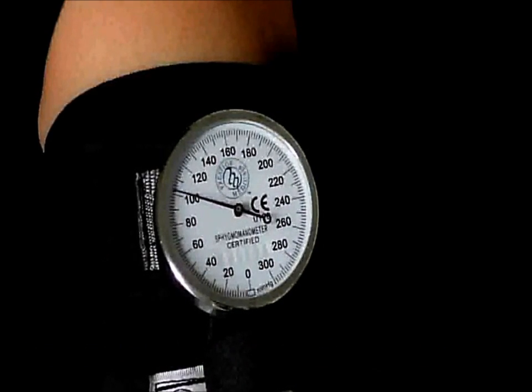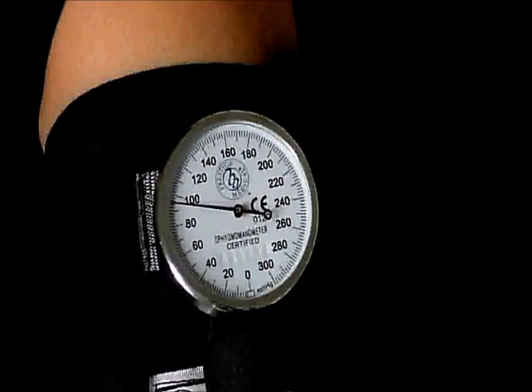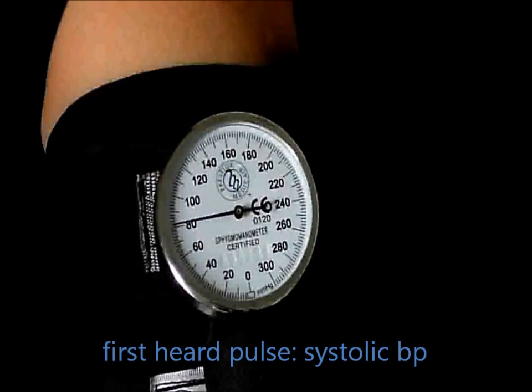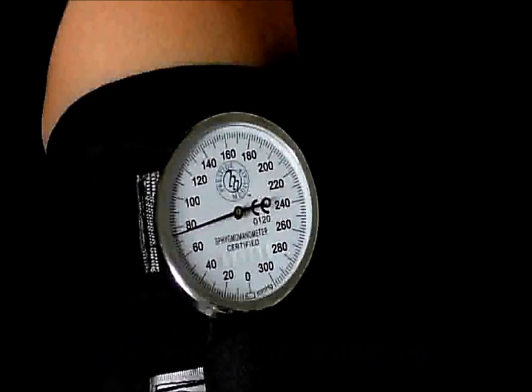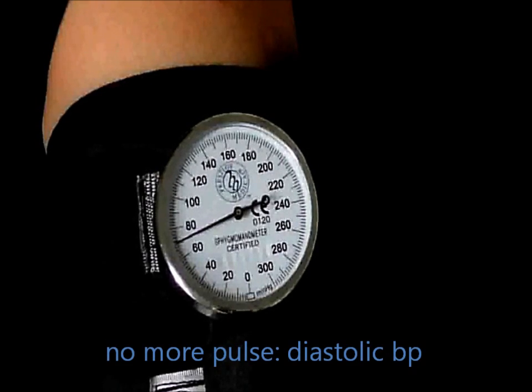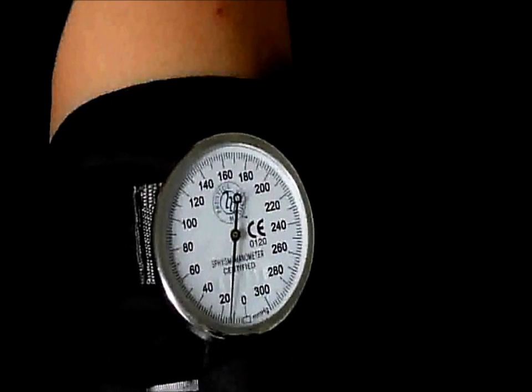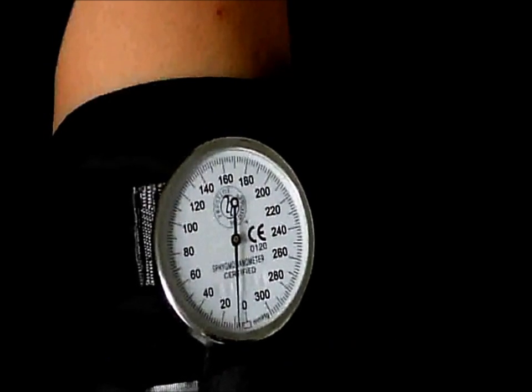The reading at which you first hear the patient's pulse is the systolic blood pressure, and the reading at which you no longer hear their pulse is the diastolic blood pressure. As soon as you no longer hear the patient's pulse, fully deflate the cuff by turning the knob on the valve all the way counterclockwise.